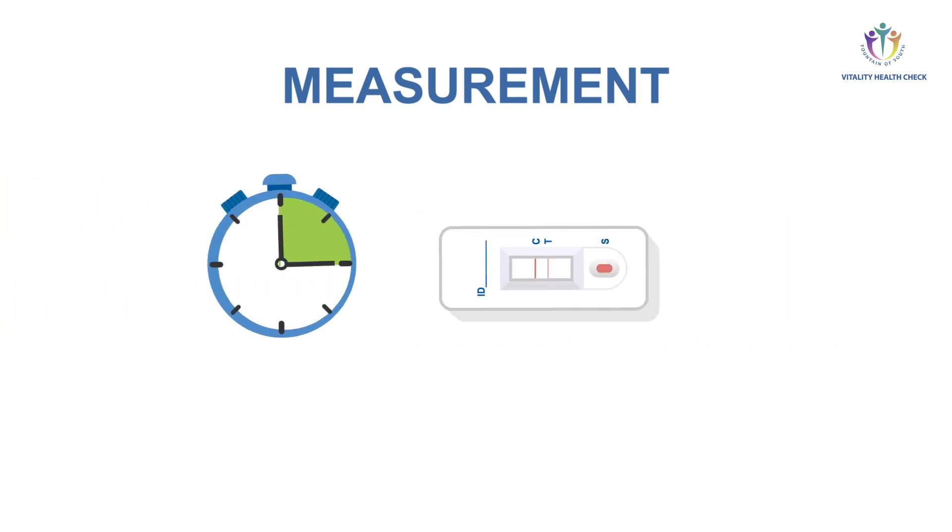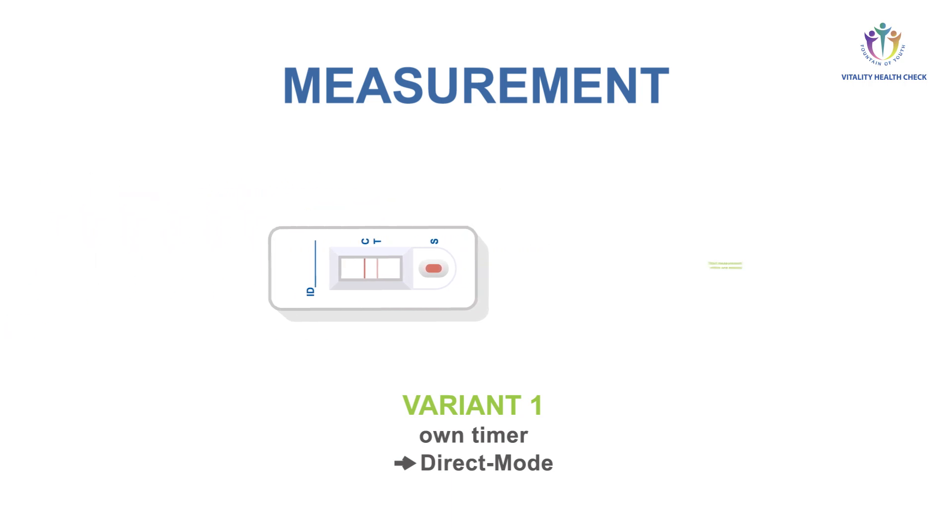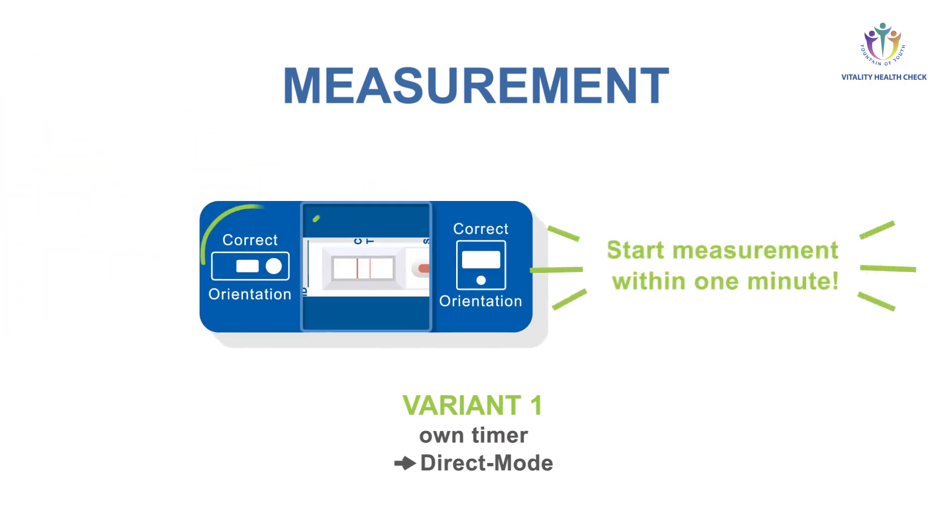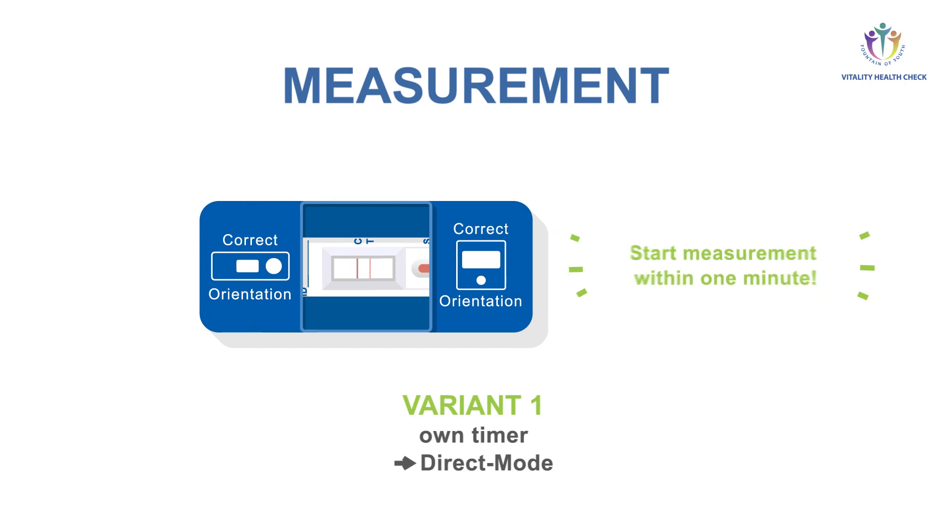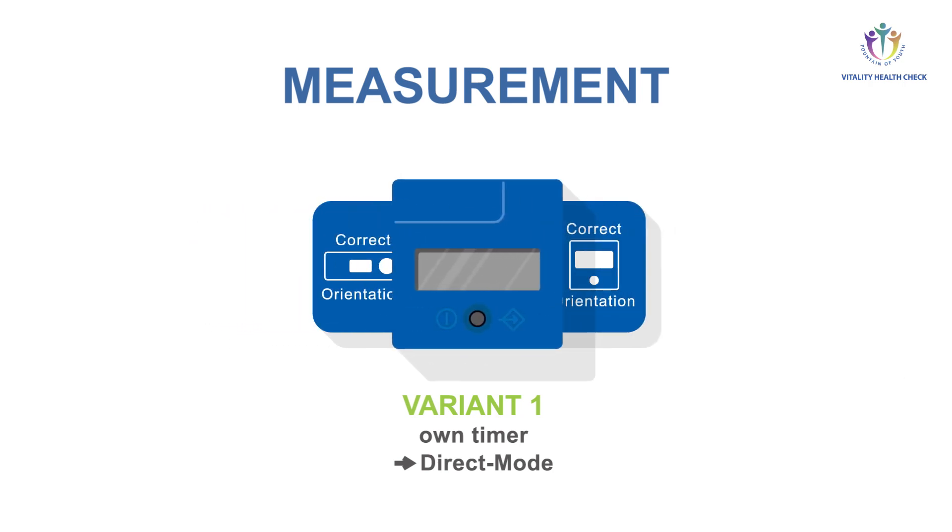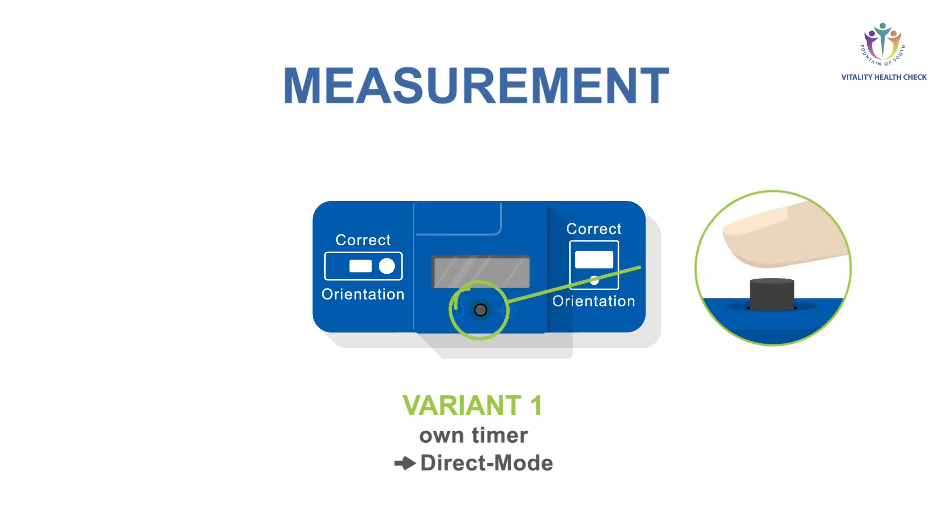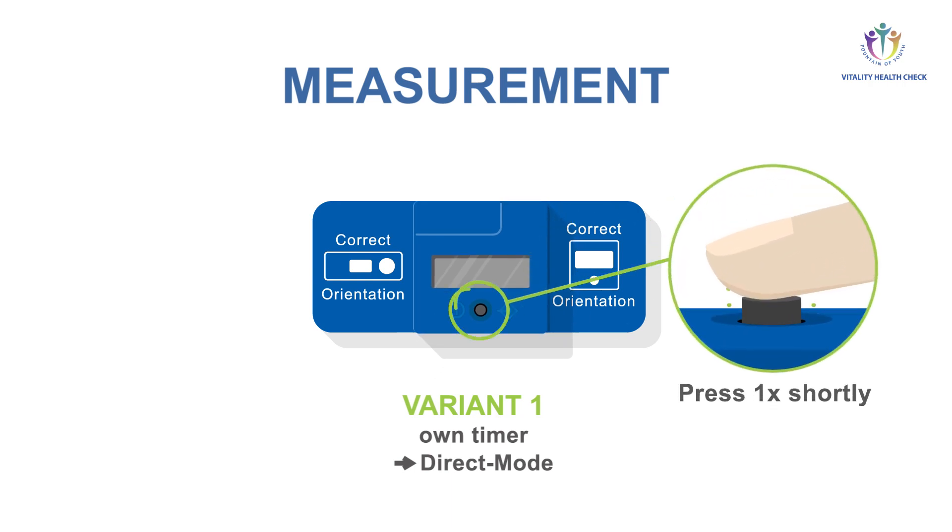In variant 1, measurement with your own timer and VHC reader in direct mode, perform these steps exactly after 15 minutes. Place adapter on the test cassette. Place VHC reader on top of the adapter. Check for correct orientation. Turn on the VHC reader by briefly pressing the button.